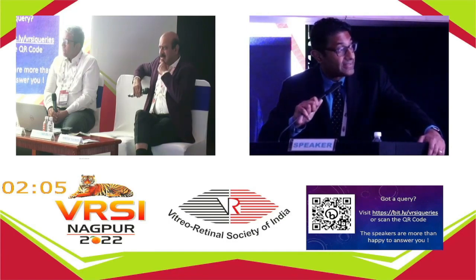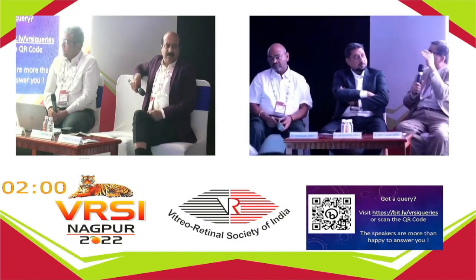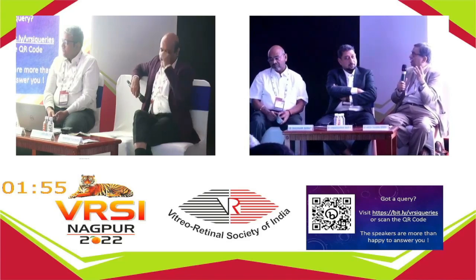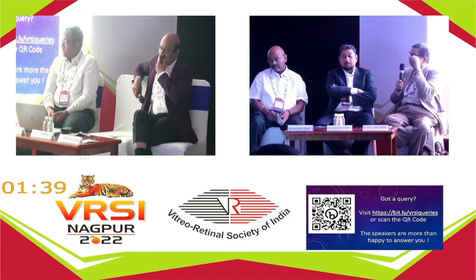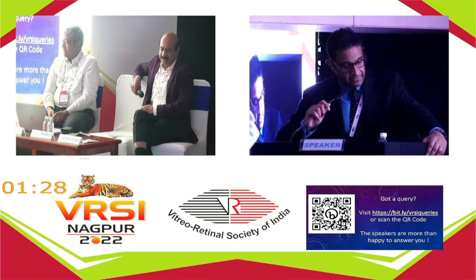The difference is 10%. Because one problem is that all these studies compared the 30 degree field. Nobody uses 30 degrees. So even if I use a conventional camera, it would be 50 degrees at least, anything between 50 and 60 degrees. If I go into the periphery with these, I actually end up with a 100 degree field in virtually every case. So what you're giving me is only something beyond that. In fact, what it shows best is that it looks very nice for sending to an ophthalmic company. A beautiful image, right, in one go. Montage can't equal that.